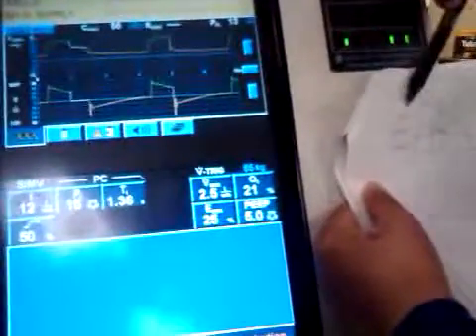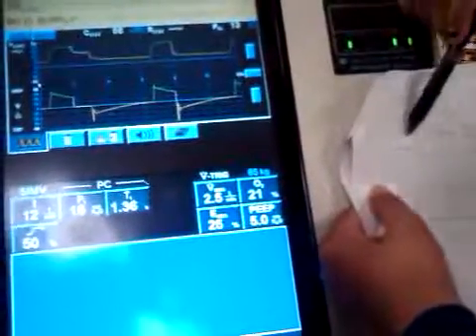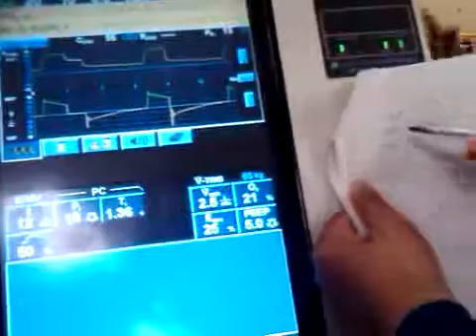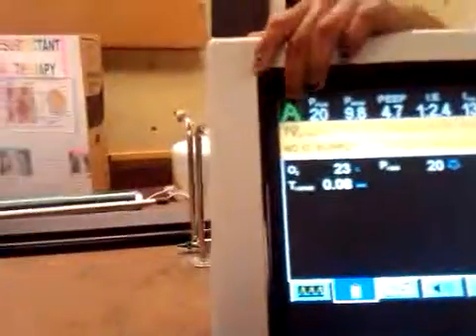Okay. So now we're going to get our total minute volume, total spontaneous minute volume, and mechanical minute volume. The spontaneous minute volume would be under the clipboard. So look under the clipboard. Don't forget to always look at your red up here while you're trying to get all 3 parameters.